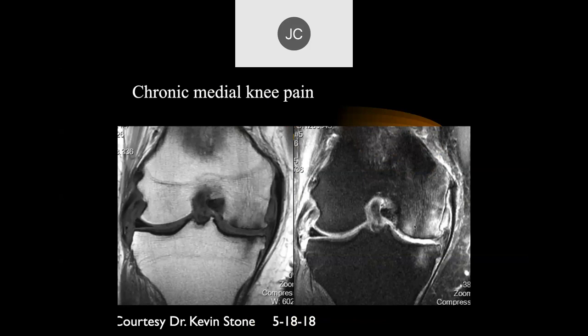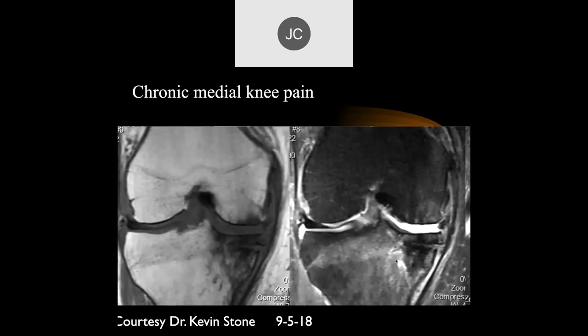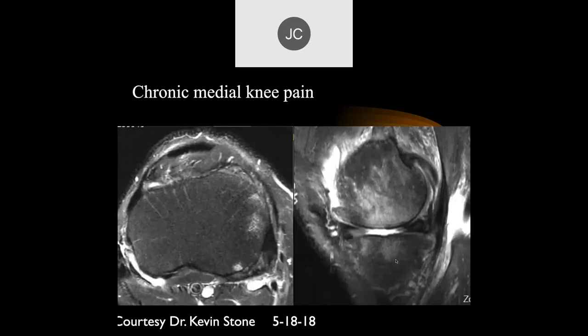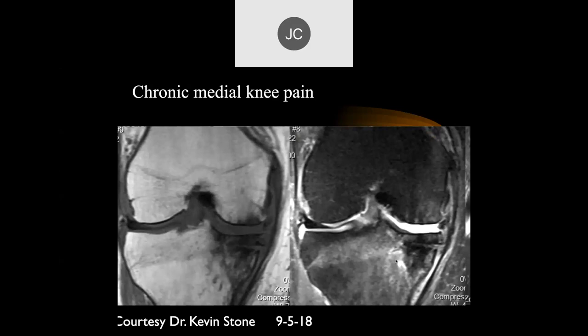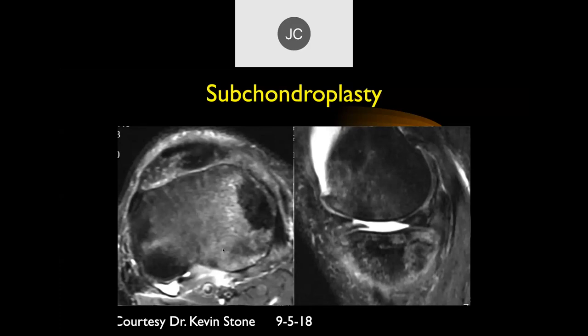Here's a case of predominantly chronic, long-standing grade 4 chondromalacia — full thickness defects of articular cartilage over large areas of the medial compartment with subchondral granulation tissue, bone edema, and irregularity of the subchondral bone. This was on 5-18-18. Four months later, it looks like pretty extensive grade 4 chondromalacia and almost looks like a subchondral fracture — and this is called a subchondroplasty.